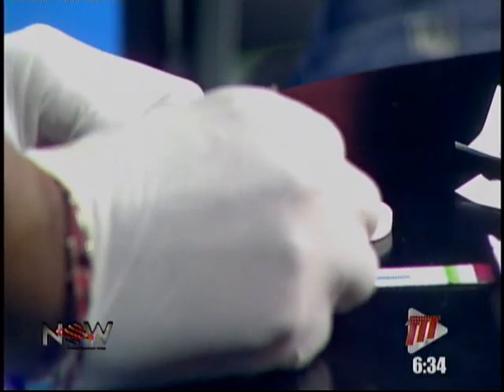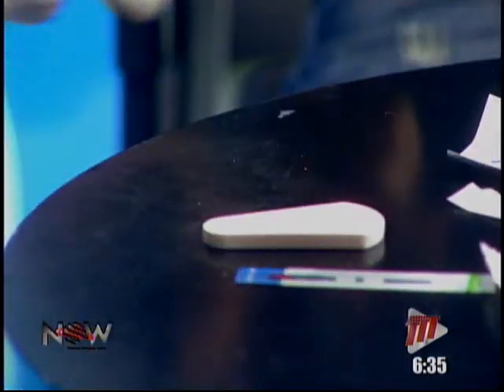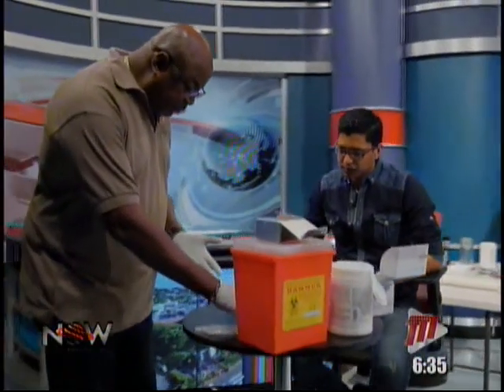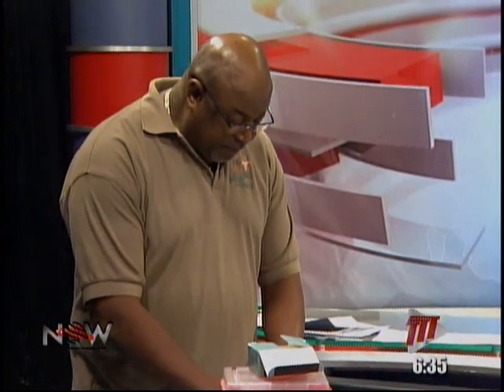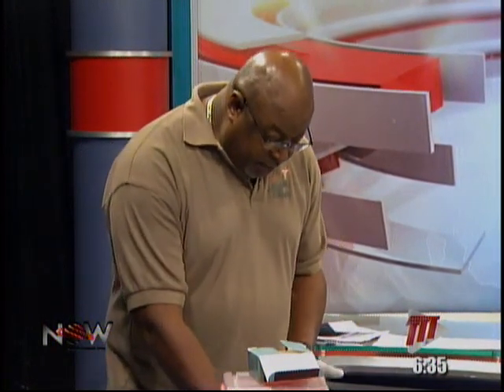And what are you doing here? So I'm putting it on the strip. The strip is used along with a chase buffer, which helps the blood flow along the test strip. In the test strip, there are antigens, so the chemical helps it flow up.